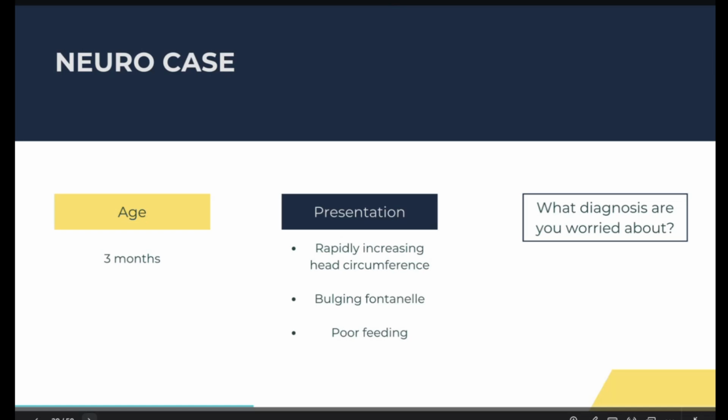We've had bleed, hydrocephalus, and hydronephrosis as ideas so far. So hydrocephalus is the right answer. I understand how bleed could have come because bleeding can also increase the intracranial pressure in someone's head, especially a baby, and they can also present with poor feeding.